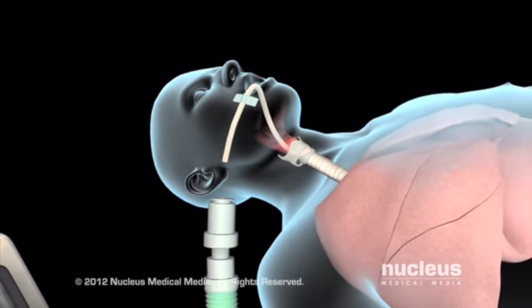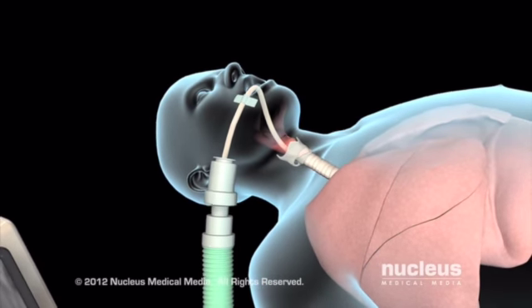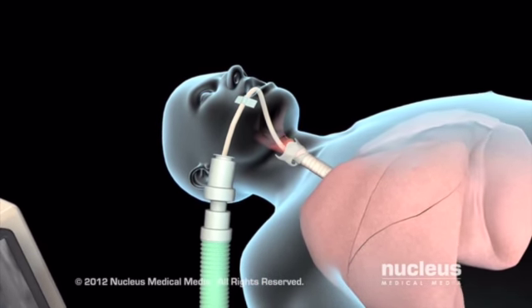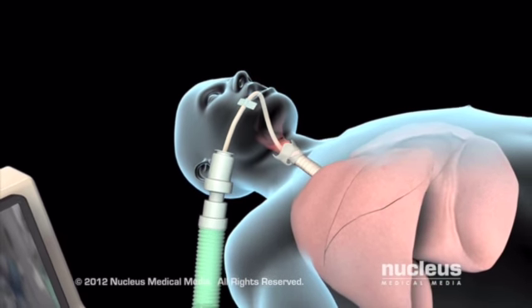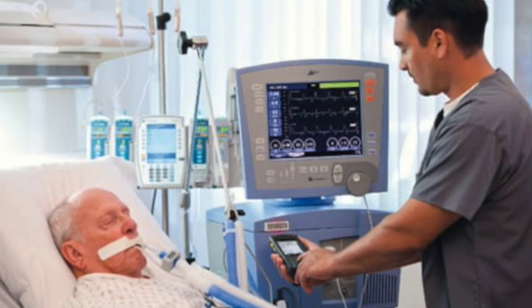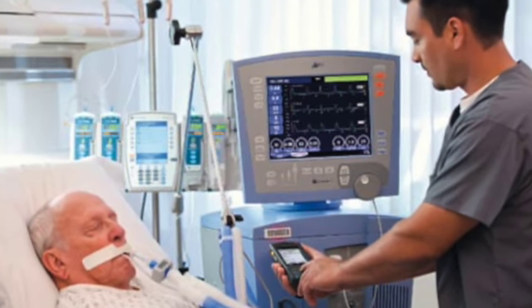Depending on the condition of the patient determines the type of ventilator. There are non-invasive ventilators, in which the patient wears a mask that fits over the nose and mouth and the air blows into the lungs. And there are different types of invasive ventilators with the tube.